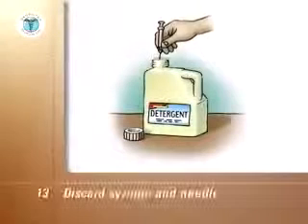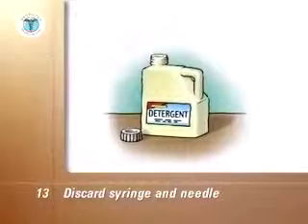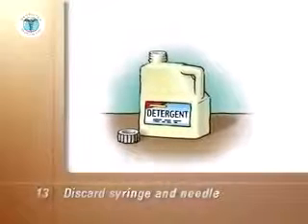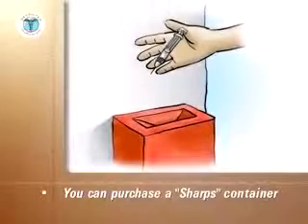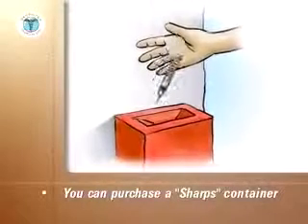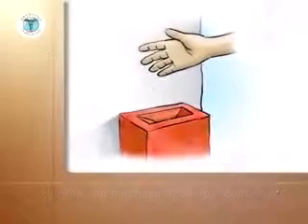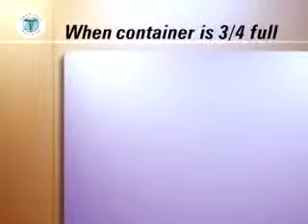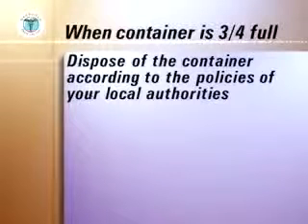Discard the syringe and attached needle into a puncture-proof container and replace the container's screw cap. Instead of a puncture-proof container, you can purchase a special sharps container with a hinge lid to store the used syringes and needles. When your storage or sharps container is 3/4 full, dispose of it according to the policies of your local authorities.